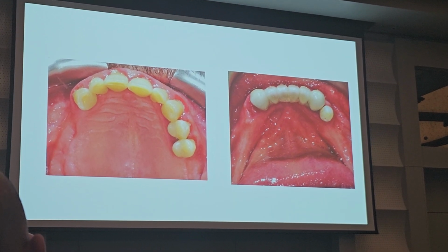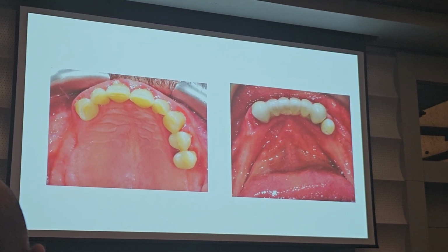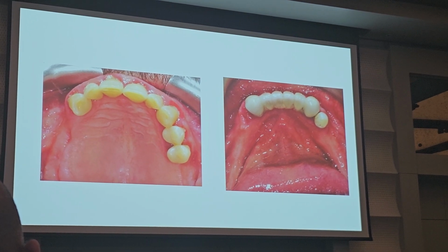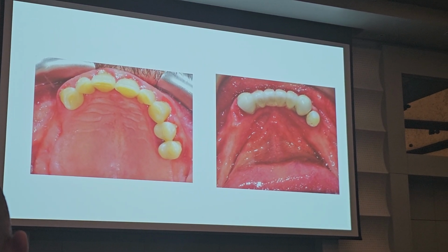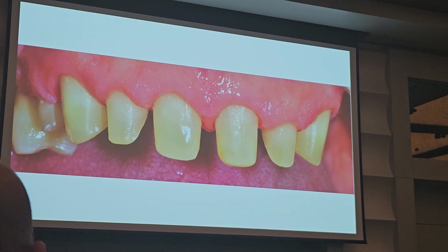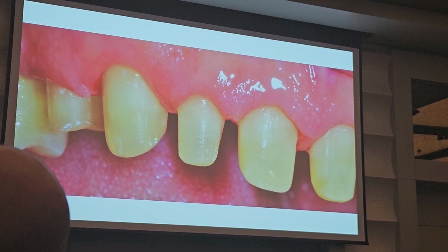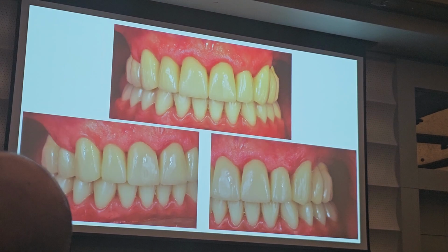So in this area, I decided to do 2 elements in extension, okay? It's feasible. With metal ceramic, it's easy peasy. Because there is a denture on the opposite arch, I will do it in zirconia, it's the same, doesn't matter. Periodontal treatments, everything was done in the correct way, honestly.